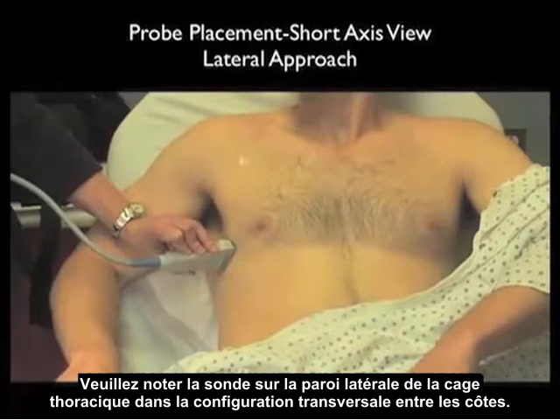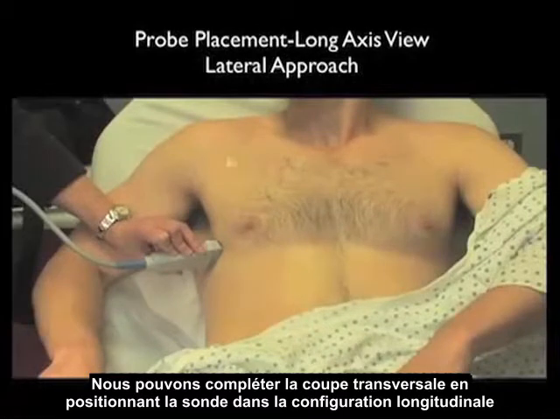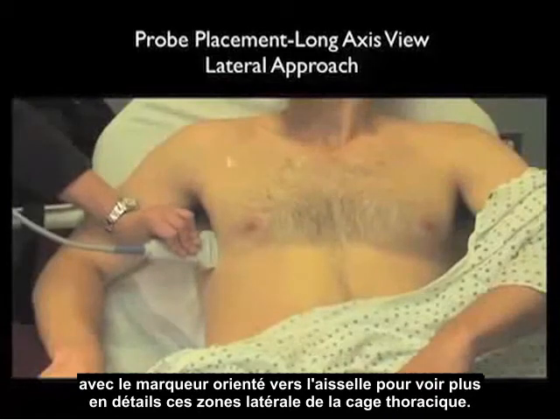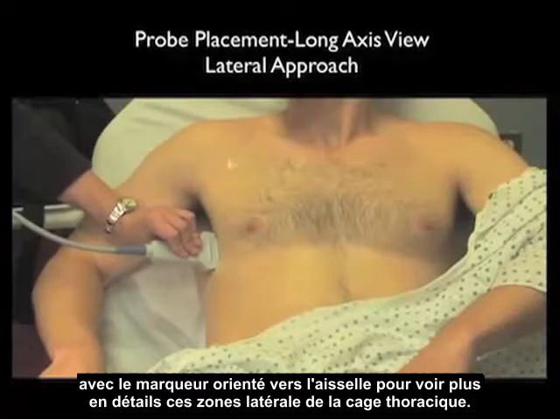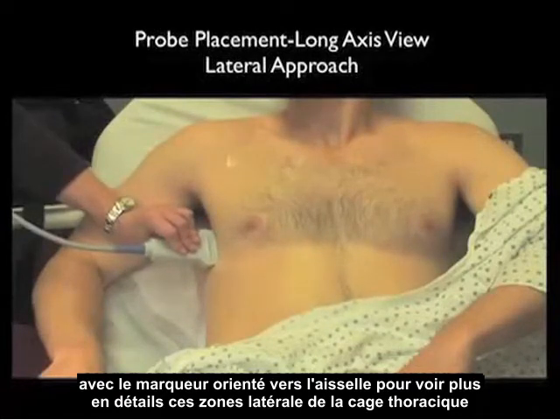Notice the probe on the lateral chest wall in the short axis configuration between the ribs. If lung is seen here laterally but not anteriorly, this would tell you it was an incomplete pneumothorax. We can complement the short axis view by placing the probe in the long axis configuration with the marker dot towards the patient's axilla to further examine these lateral areas of the chest wall.